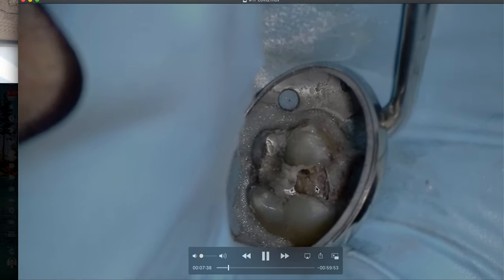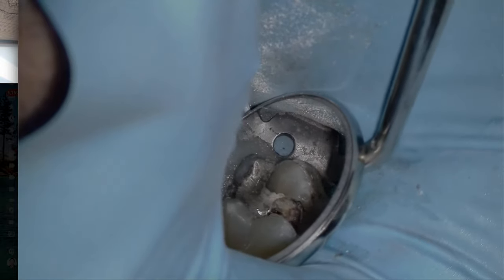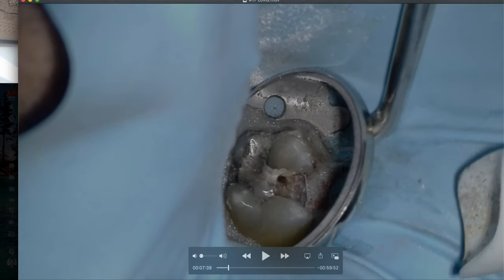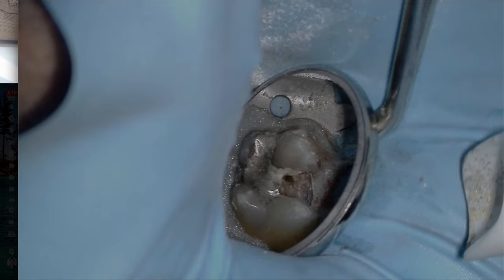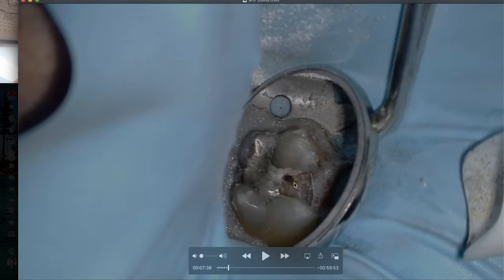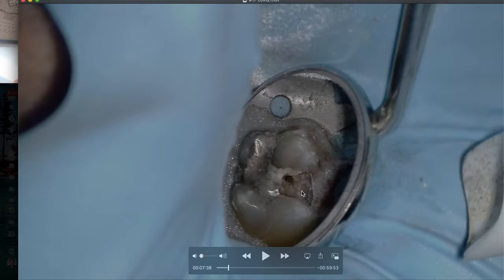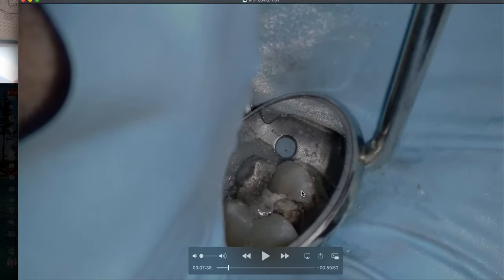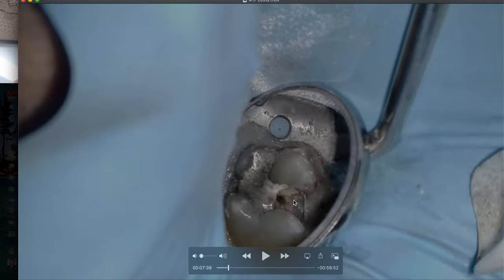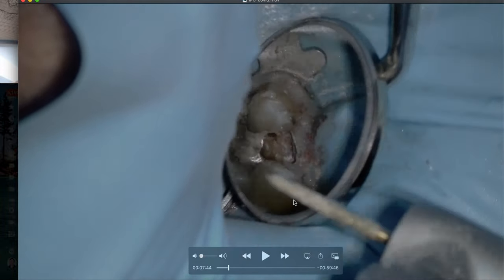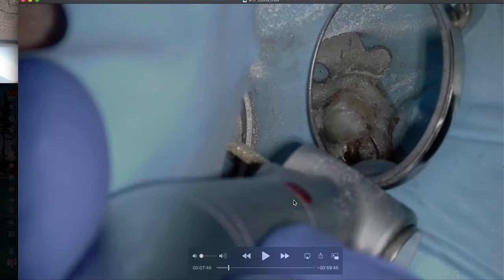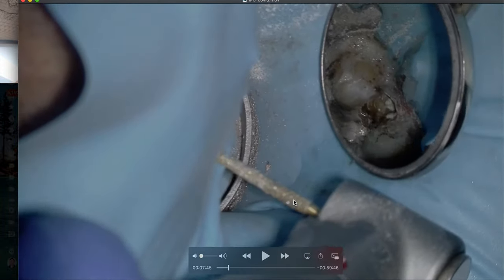So what I'm doing right now with this long shank slow speed burr, number two round, is I'm headed towards right towards that palatal orifice and boom, I'm in. So that palatal orifice on a maxillary tooth is usually the biggest orifice. You can see it right there. And this is a great time if the patient feels something and you want to do the absolutely incredible technique of doing an intrapulpal, which can be excruciatingly painful, this is a great little hole just to place your anesthetic syringe into and get great back pressure rather than trying to do the whole access and then try to get some pressure into the pulp chamber.